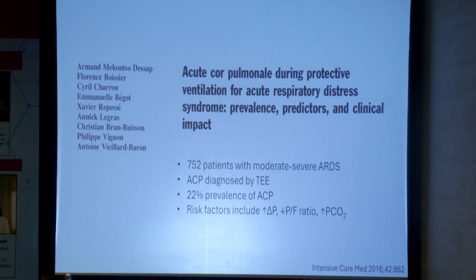So when you remove the cannula, you continue anticoagulation for how long? It depends on the situation. There are patients who we manage with VV ECMO with no anticoagulation, so it's not necessarily continued. If they have an indication for anticoagulation for some other reason, you typically would hold it for the decannulation and resume it maybe 6 hours later, maybe longer, depending on if they're bleeding, if their hemoglobin is stable, what their coagulation counts are. There's not a similar rule. The underlying condition matters too. H5N1, COVID, we kept them for 6 months. Right, but in terms of when to restart it after removal, I think it's going to depend on the specifics.